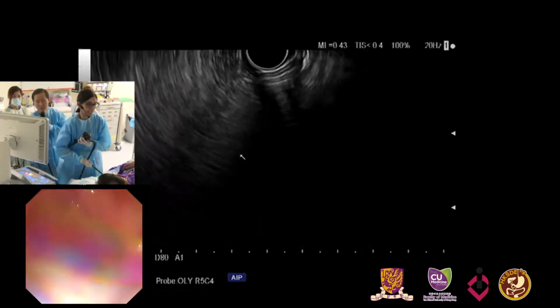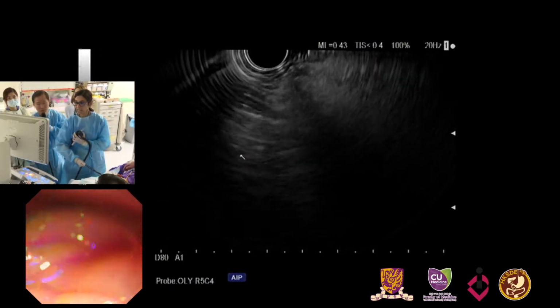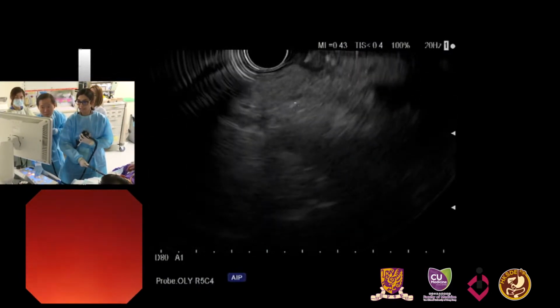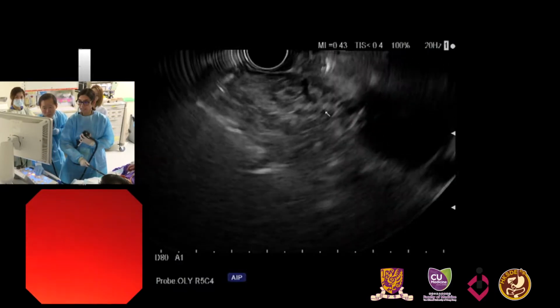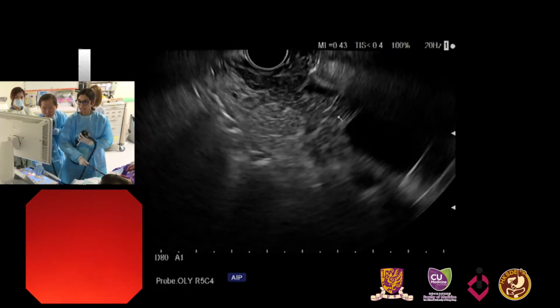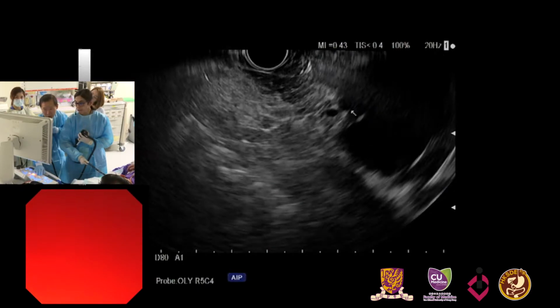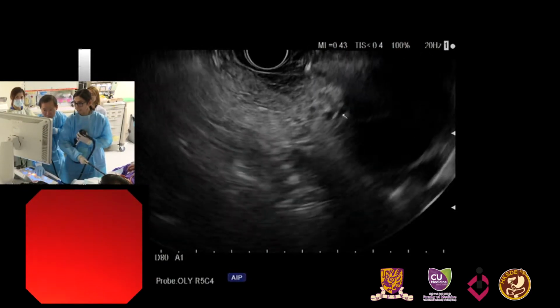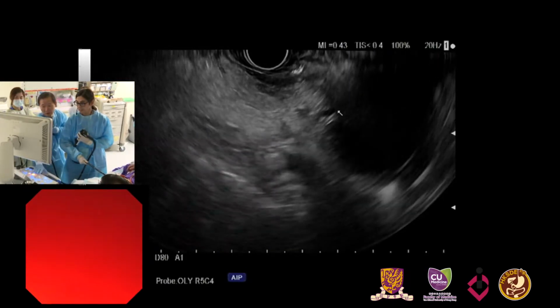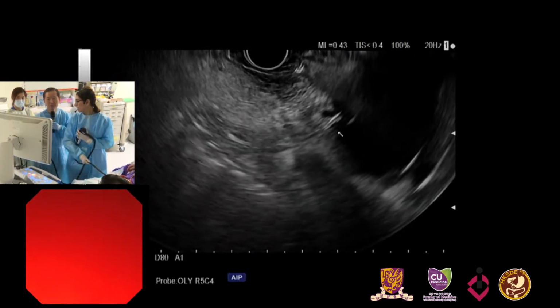with the pancreatic duct? And if we go into the D2 position and start pulling back, you're going to see the uncinate parenchyma, and then you're going to start seeing the pancreatic duct right there. And we do see pancreatic duct communication with the cystic lesion. Yeah. So now you could argue... This is cystic lesion, this is pancreatic duct. This is a beautiful demonstration of communication of pancreatic duct and the cyst. Yeah. So we probably both agree that this is an IPMN lesion.